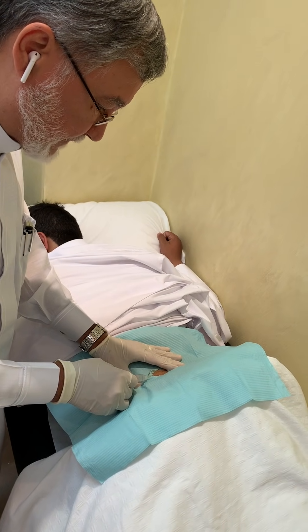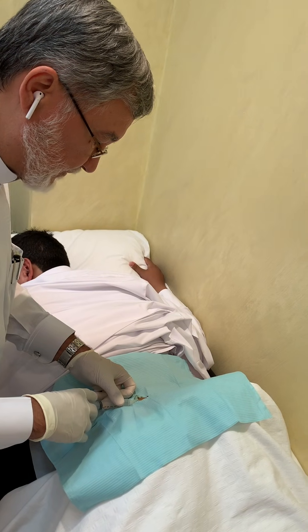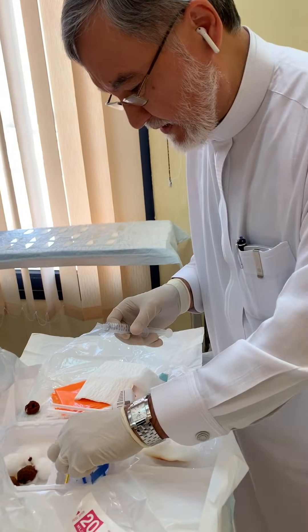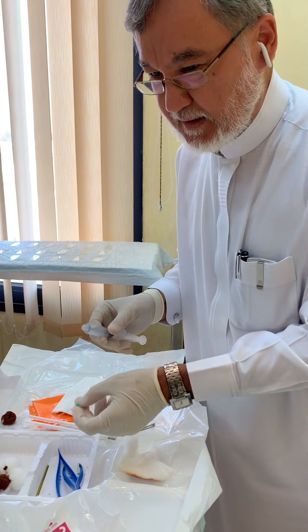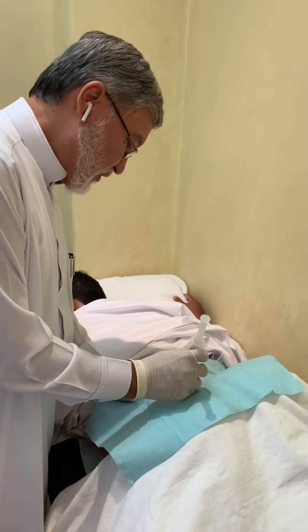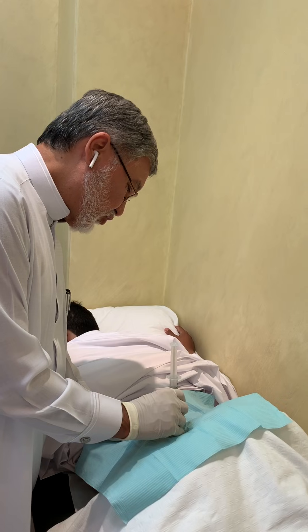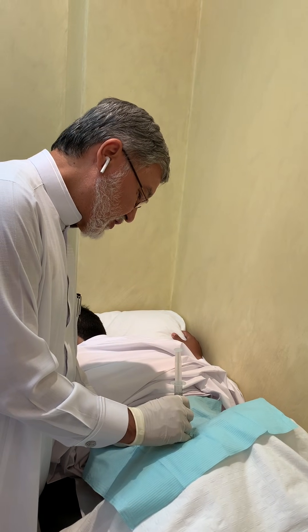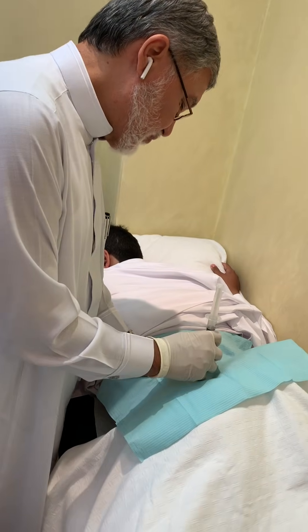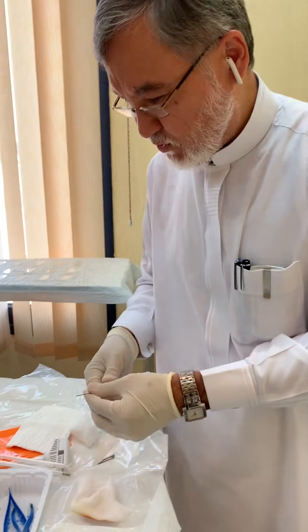I will inject into the dermal layer only. It's better to keep informing the patient what I am doing, so anything expected gives them less surprise and they will tolerate it better. Now, the subcutaneous tissue is not so important to anesthetize — more important is the periost. So almost directly I go to the periost, and as I expected because he is obese and a little bit muscular, I cannot reach the periost with this needle, so we will use the spinal needle.